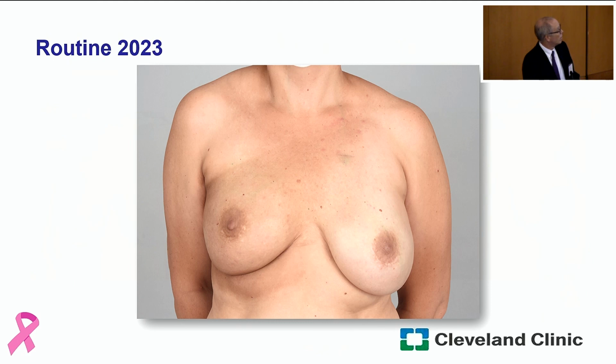So now, with an implant, we can get a superb result. Arguably, it's made better by radiation therapy. This is what the patient prefers. So now you've got this. It's very hard for me to match this. You would think with all those things I did, I have to put a lot of scars on the breast. And this patient actually went away from me mad. She found another plastic surgeon. He did something. It didn't work great. It's very hard to do, so this is not even a criticism against him. Because that breast now has this implant in it, there's not a lot of tissue that I can rearrange to make this better.